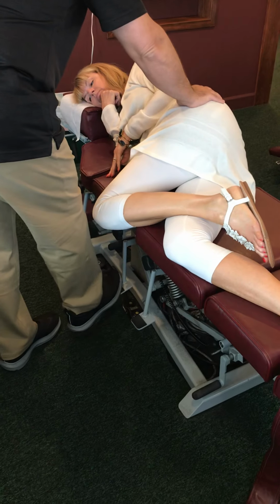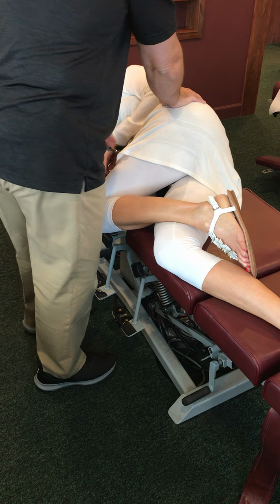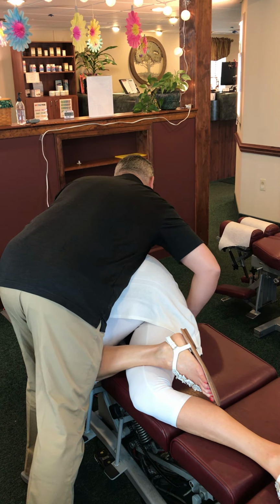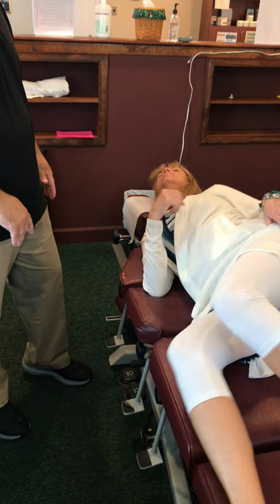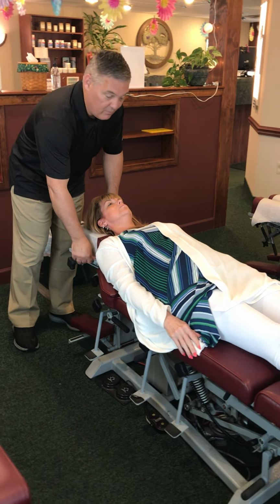Okay. Patient goes on their side. Lumbar and or pelvic piece, either or both come up. And we do a gentle pressure down and we just adjust in, and the table will drop as we push down. Cheryl, let's have you lay on your back for me. We also have our straight side posture, which I know you guys are familiar with.